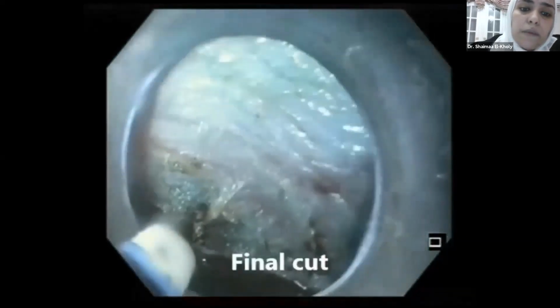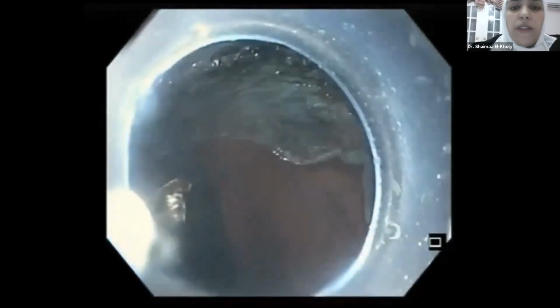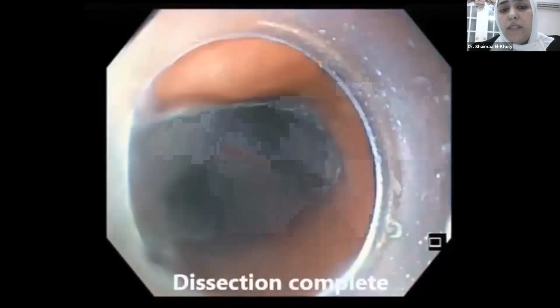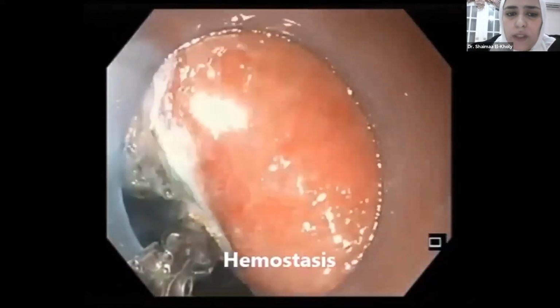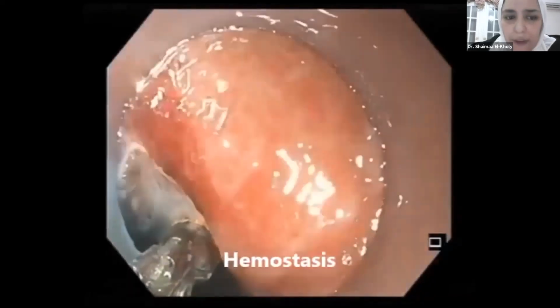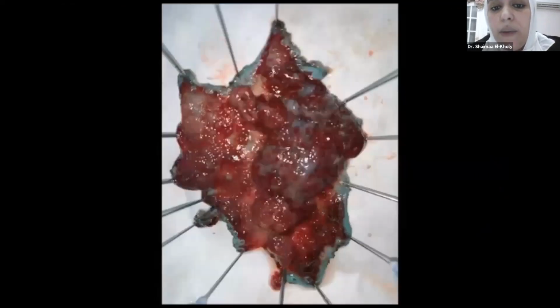And here, there's the final cut. And then there is the lesion bed. The lesion is finally excised. And then, of course, you have to ensure hemostasis. This lesion leaves a big raw area, and it may have post-ESD bleeding. So here's our lesion that was removed en bloc.